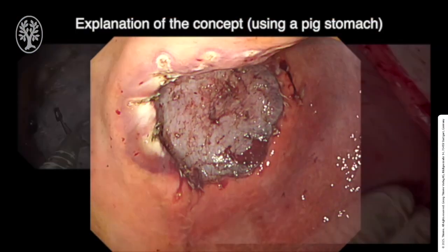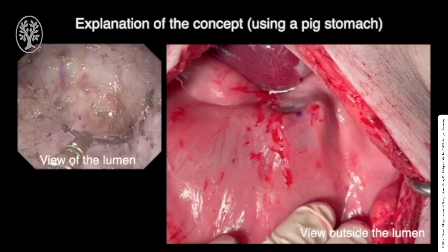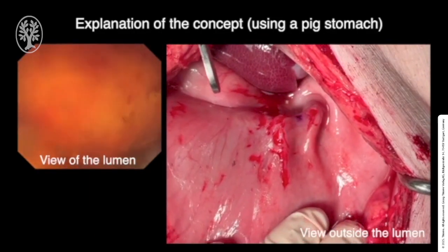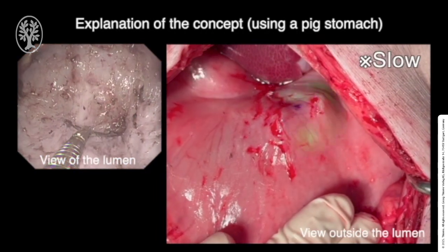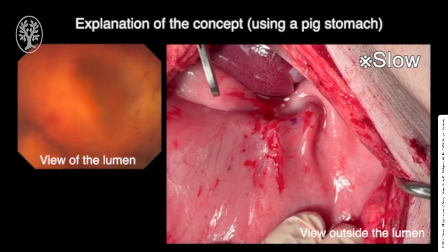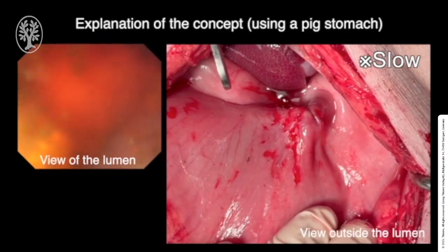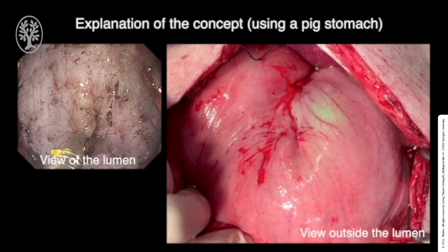I'm showing what is happening when folding the muscle layer in the origami method. This is a gastric mucosal defect in the pig. Folding the muscle layer can close even the serosa of the stomach. It looks like surgical suturing. So we hypothesize that the origami method can achieve reliable closure even for the large defect after duodenal ESD.